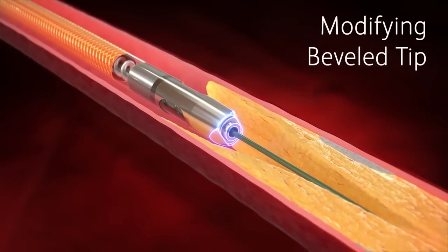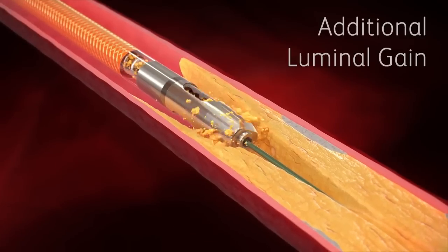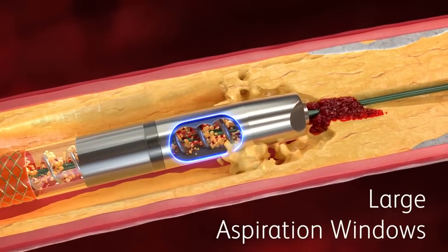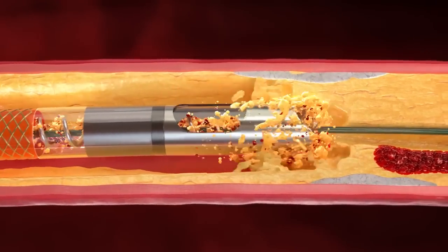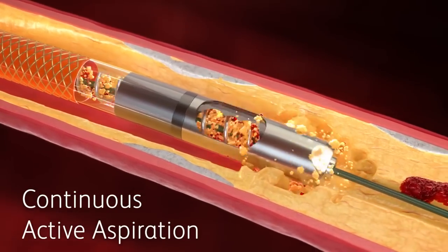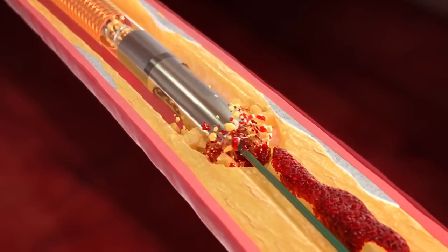Once the tip initiates modification of the target lesion, liberated material is drawn into a vortex around the device tip. The desired outcome of the vortex is additional luminal gain. Two large aspiration windows efficiently evacuate debris. The Rotarex catheter's continuous active aspiration ensures negative pressure at the device tip at all times during activation. A fixed inner serrated cylinder is designed to further break down remaining fragmented material.